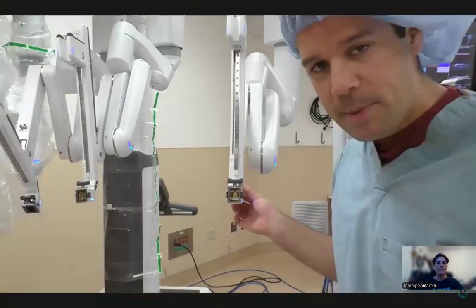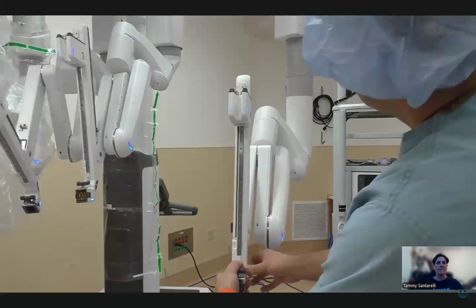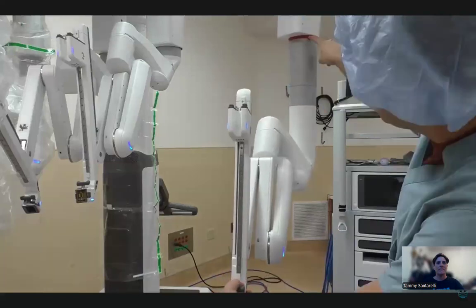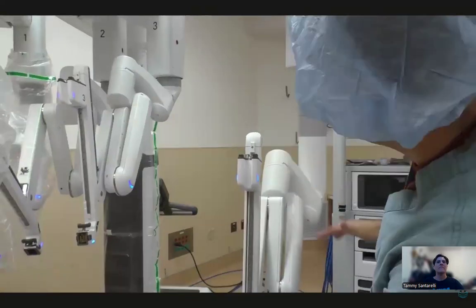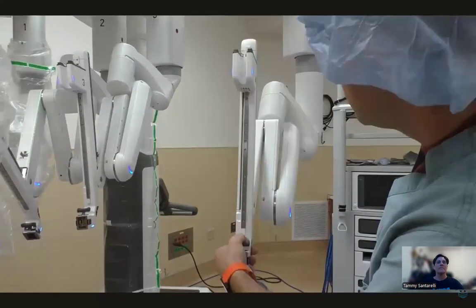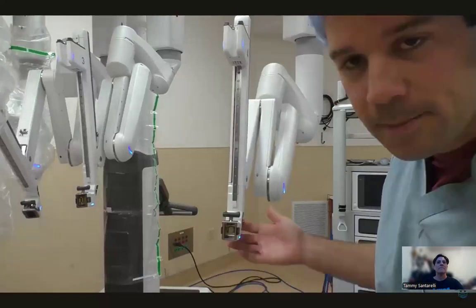One other use for this back button is holding it down and pulling the arm all the way down. You'll notice it's red right here, and that's going to enable the sterile person to lower the boom, all by the touch of that button.